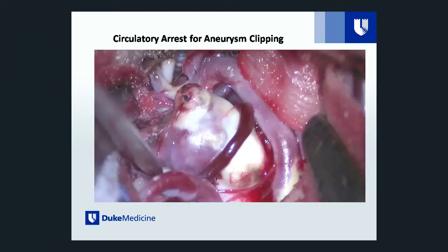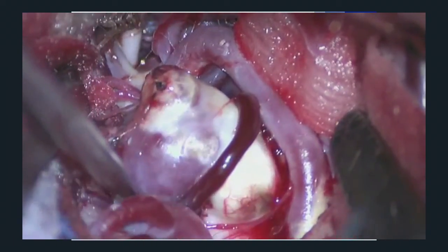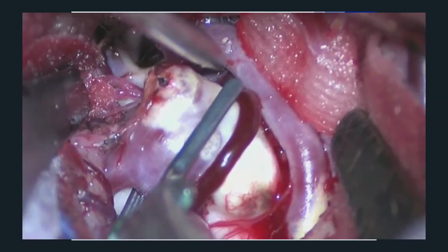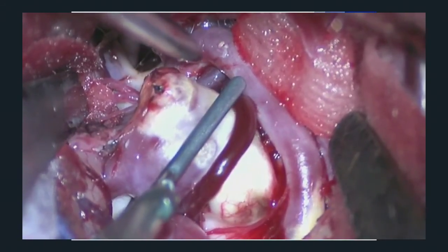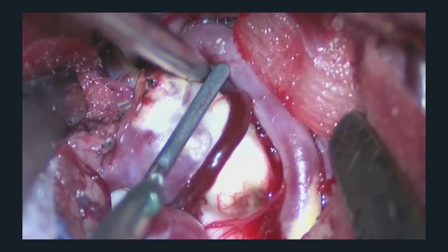This is very meticulous surgery, and it's actually very difficult surgery, so it's important to have the training in it. So this is what you see when you look under the microscope. This is the main blood vessel coming up through here, and it's branching into this main trunk here and this smaller trunk up here. This is my little suction device. This thing going across the aneurysm is a vein. Now, as a rule, I try not to injure any of these blood vessels when operating.